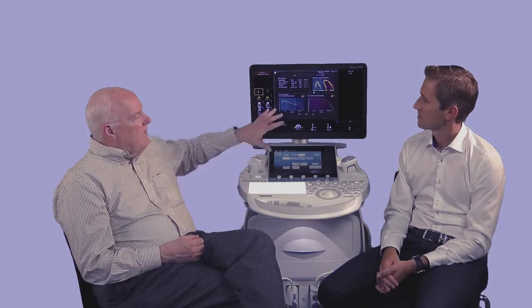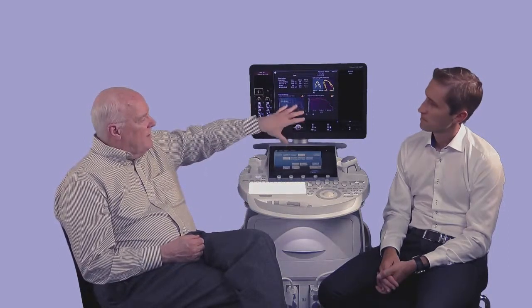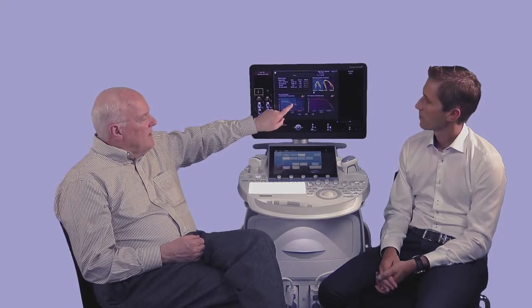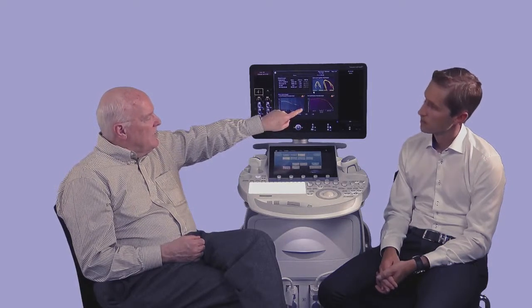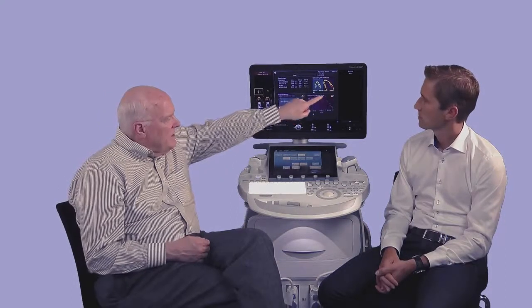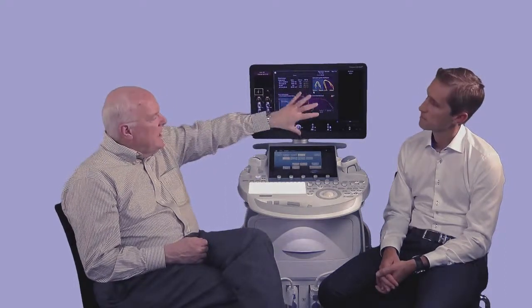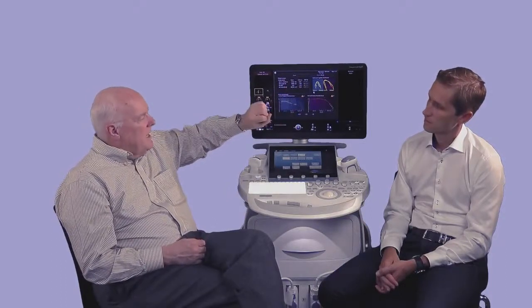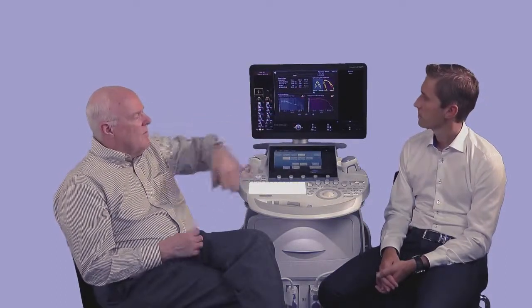And I can then see graphically, for example, here we have an example of a fetus with a coarctation. We can see graphically that the left ventricle is decreased in dimension, in width. The right ventricle is dilated. We see here there's abnormal contractility. A lot of things I just see visually on the screen instantaneously, so I can look at it, know exactly what's wrong, and then go from there. Now, this obviously provides a lot of very detailed information on how the heart is contracting and how the size and the shape of the heart is.